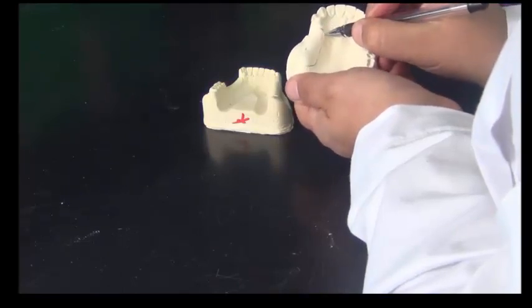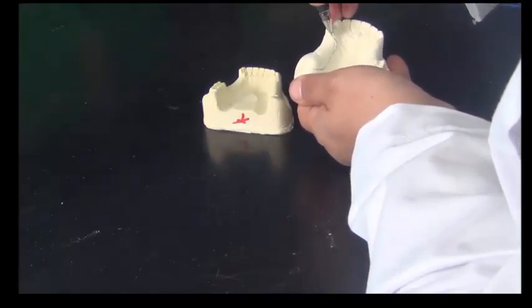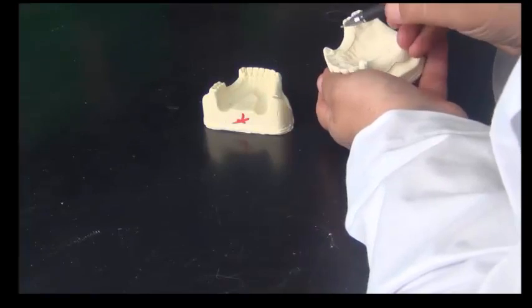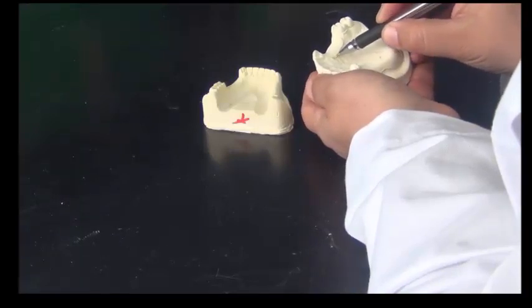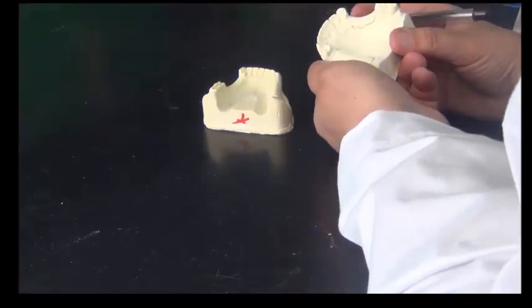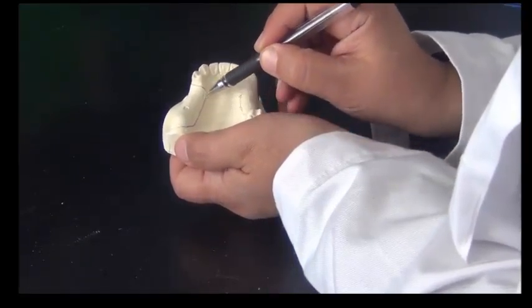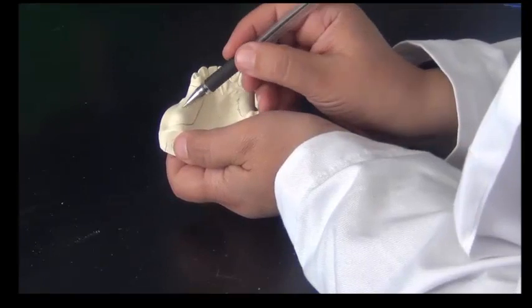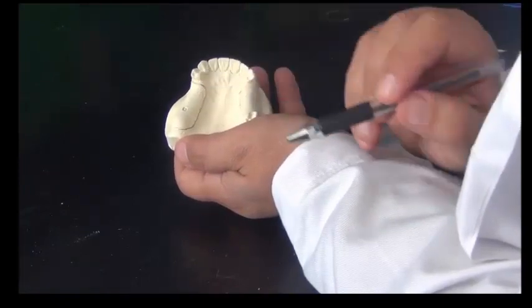We're going to continue up to here. We're going to fill in the proximal. Once we fill in these angles with wax, this wax will turn into metal, and they will form the same thing, margins. These margins are called internal finish lines. We continue around the palatal side and then into the proximal surface as well. These are their extensions. On the upper, these are the distal, palatal, and mesial proximal finish lines around the gauged relief. Also, we're going to fill in this box. This will become metal, and it will become a stopper here.